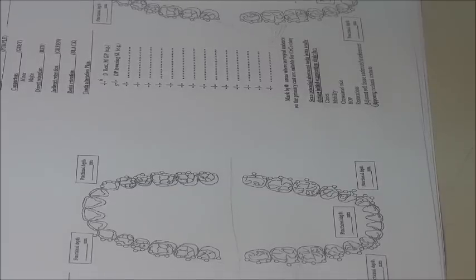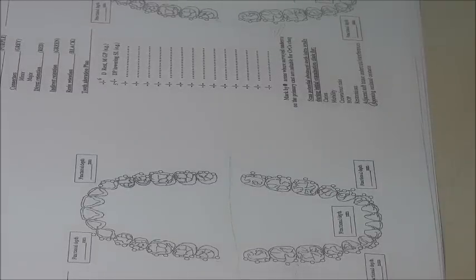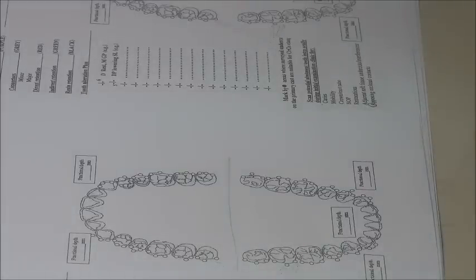So the functional depth of the sulcus is when the muscles around are working. Do you remember when we had in the exam, what are the muscles working? Border muscles. Some muscles are acting directly in the form of freni. Some muscles are close by, but they are active in that area, close by to the border, and we call them muscles around border areas in dentures. These are the same in complete dentures. We have taken that in full depth, in detail.